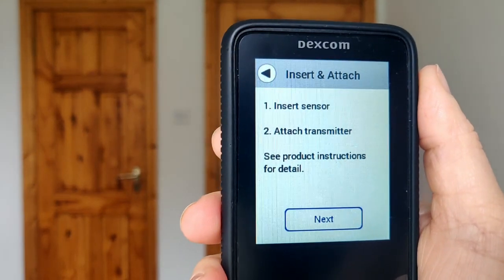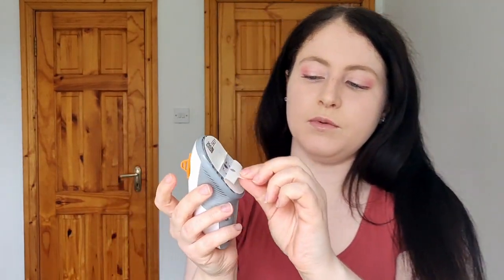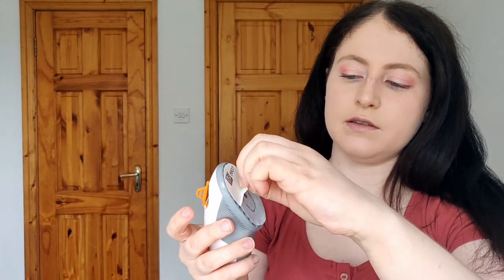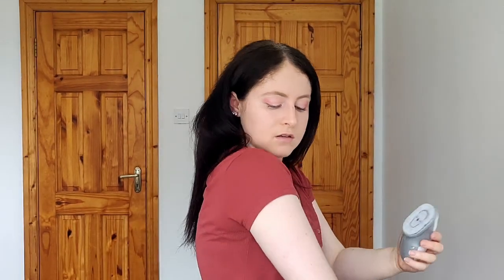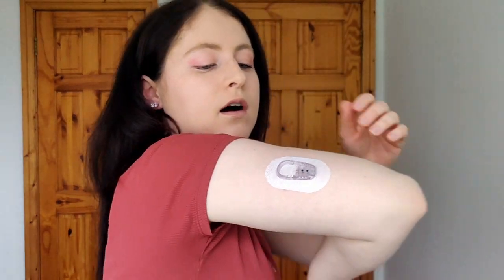Now it tells us to insert the sensor and attach the transmitter. For sensor application, you take off these two bits — that's the shape of the sensor ready to go. You can also break off the tab beforehand; I like to do that because it's easier before it's on your arm. When you press the button it applies the sensor, so I'm going to put it on my arm about here and press the orange button — and the sensor is on.